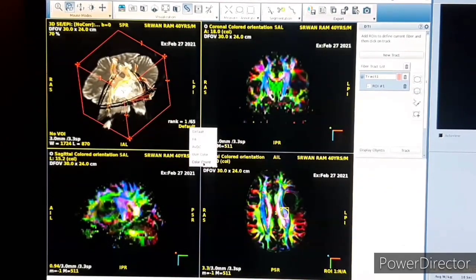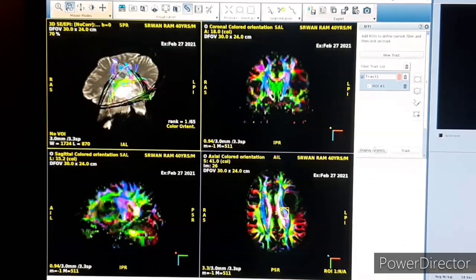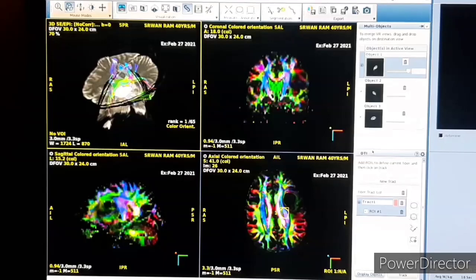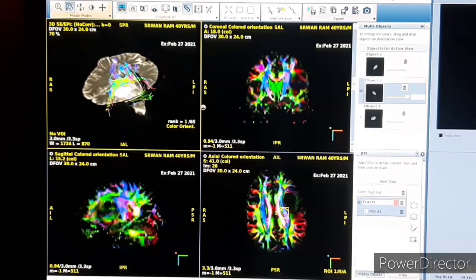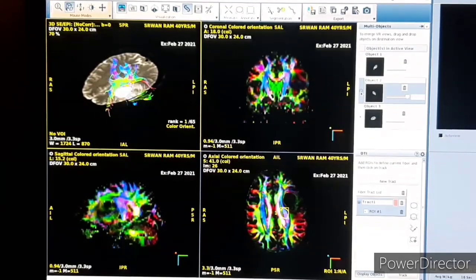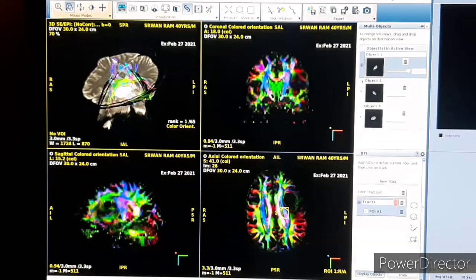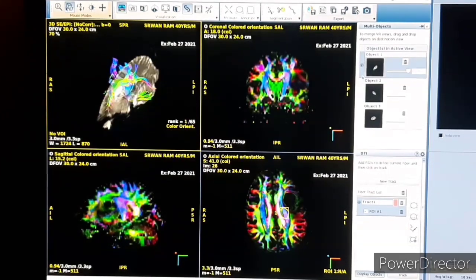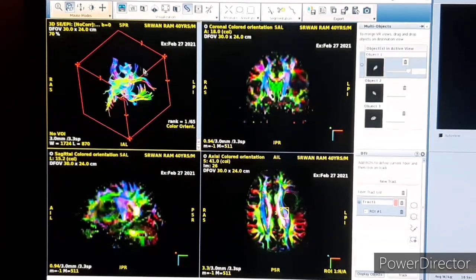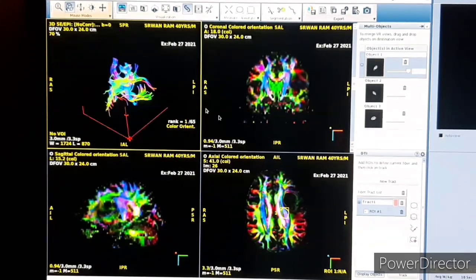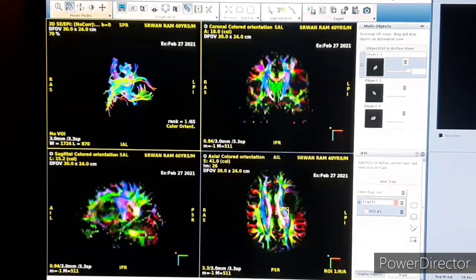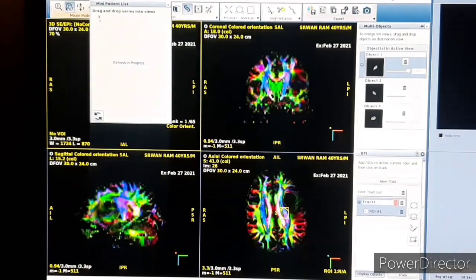You can see the nerve fibers here. Then we will adjust the color — we will set the color options. Now we will go to how to make the nerve fibers and tumor in the 3D model.